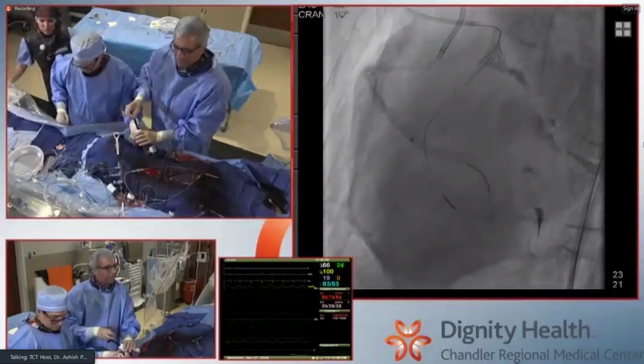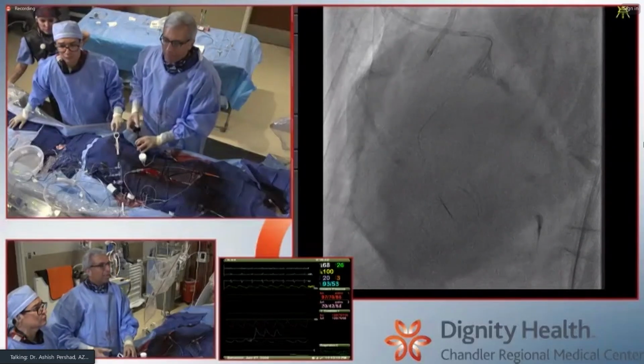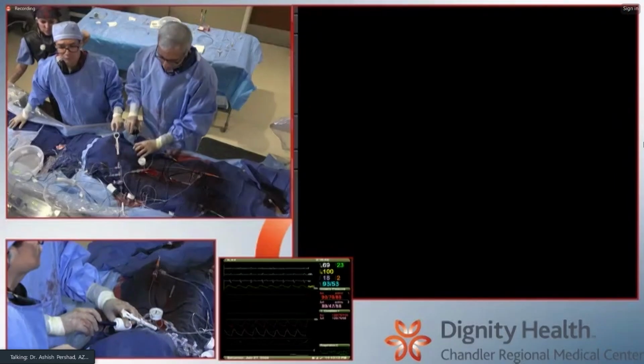As long as you're comfortable where you are. Maybe the point I'm making is that you don't have to go that deep. But I'm already committed based on where the previous stent is.